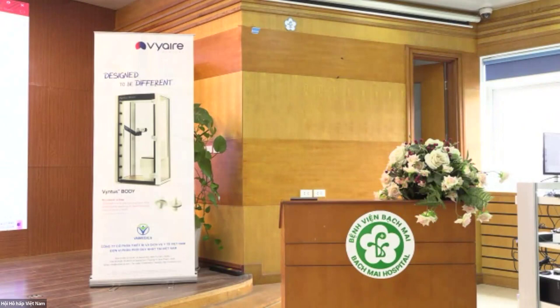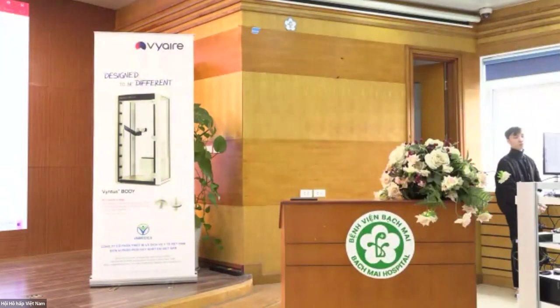So how can we interpret the result for a patient with diaphragm paralysis? If you end up with a respiratory muscle strength measurement, how do you interpret those? There are predicted values. The most commonly used ones are those by Black and Hyatt, Hyatt being my mentor. So they have predicted values out there for those individuals. Assess the change in VC between upright and supine. If it is greater than 8% difference between the two, then you can say that there is an impact of diaphragm dysfunction, or whatever vernacular you would like.